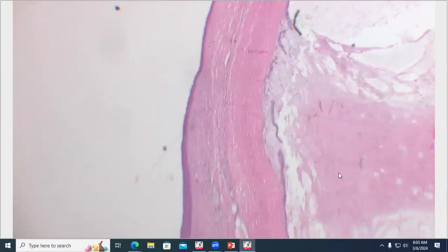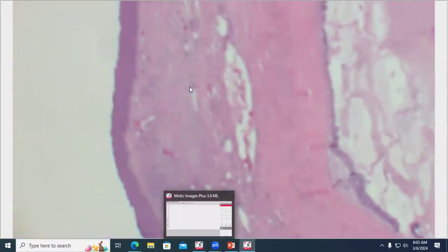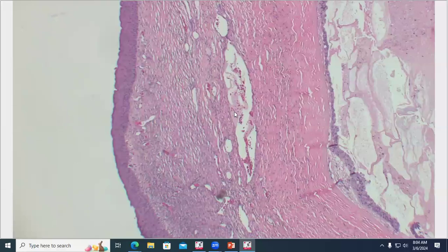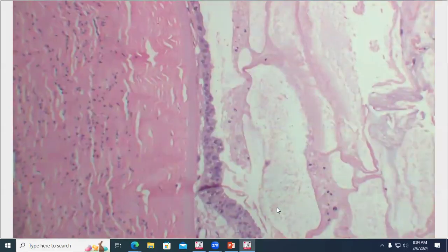So we can get started with the cornea. The corneal epithelium is thickened, so it is hyperplastic, and the stroma is quite busy. So we have corneal epithelial hyperplasia and corneal stromal fibrosis and vascularization. Look at this gigantic blood vessel there. And then as we move further in, we start to pick up something abnormal. So this is not corneal endothelium. It is much too thick for that. Let's take a look at what it is.